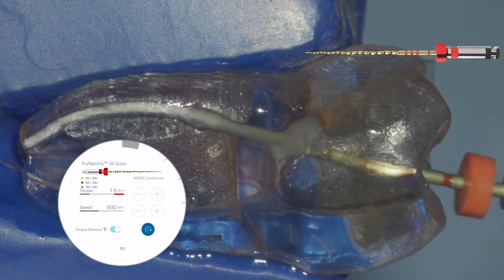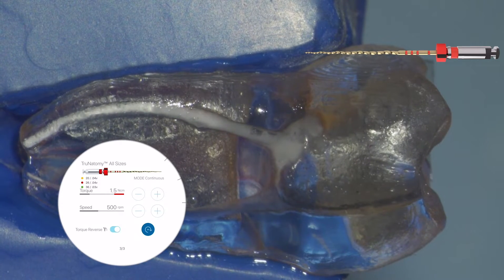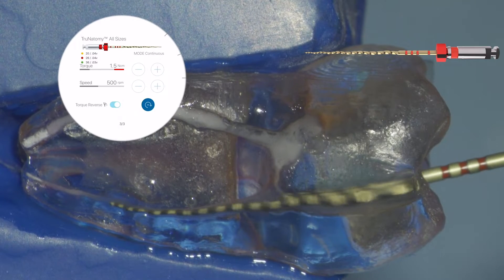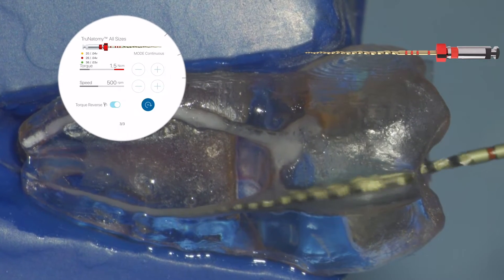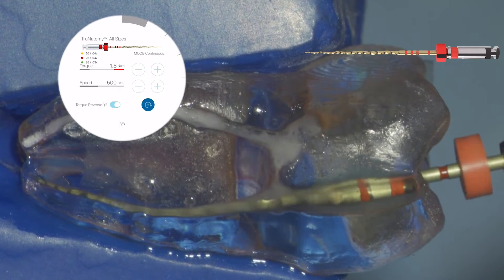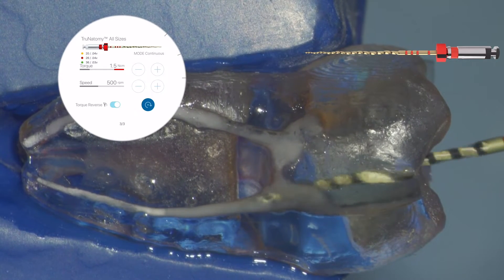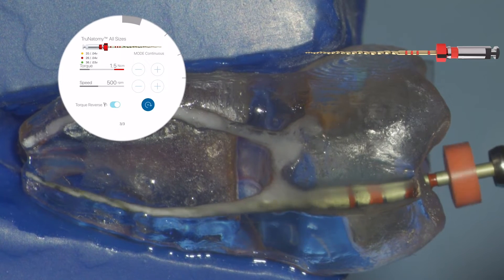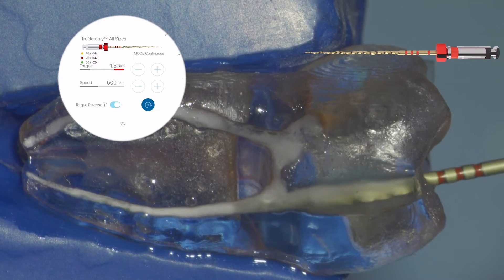Make sure the motion is nice and easy, flowing — no pecking, no stalling. Keep it smooth. After using the prime instrument, you'll see more debris in the chamber than before, so remember to always rinse the chamber and irrigate the canal.